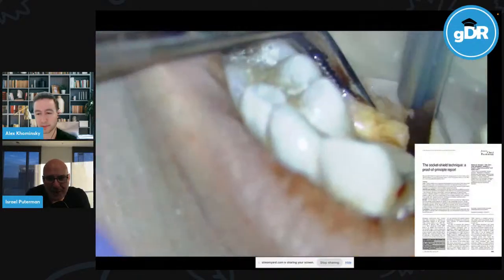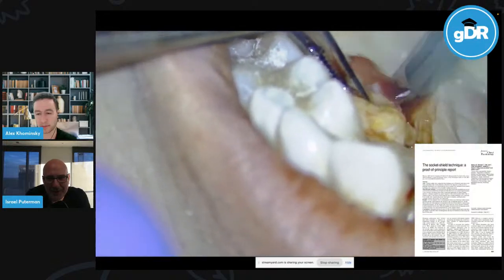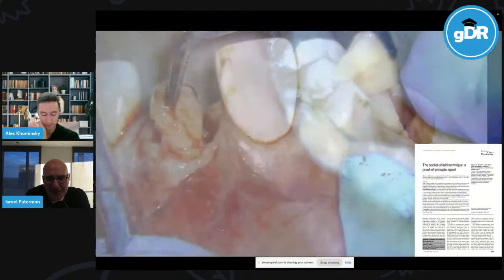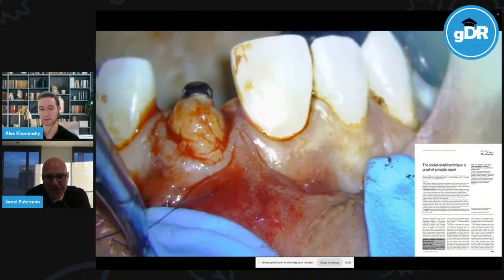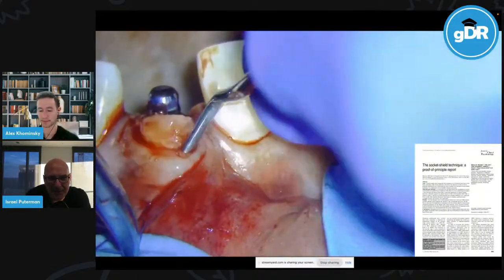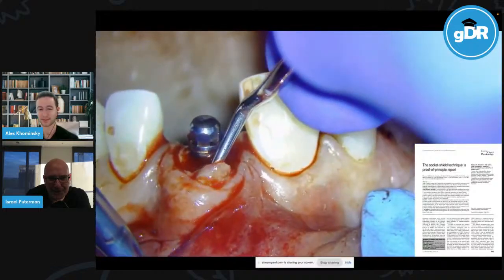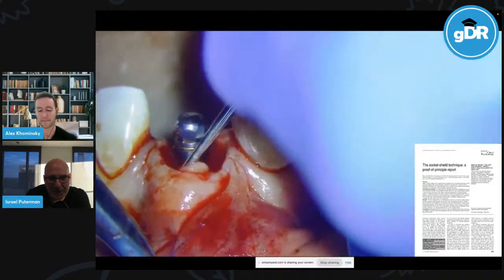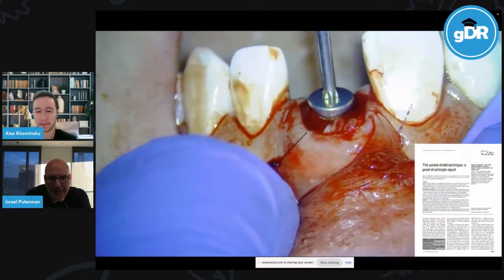I did want to correct that. So I was going to do a connective tissue graft to try to help bring the tissue down. So I place my bone graft in the jumping distance. Place a connective tissue graft using a little tunnel technique, not raising a big flap.